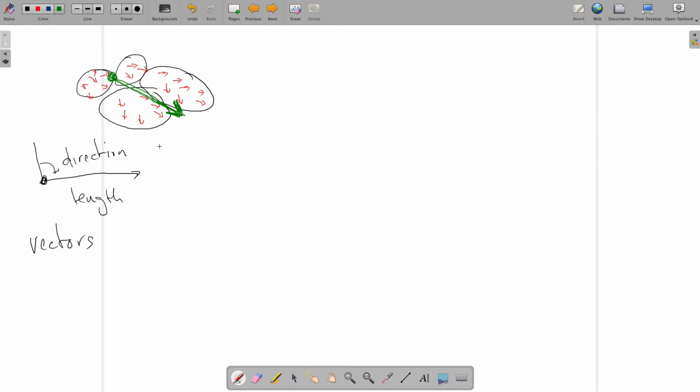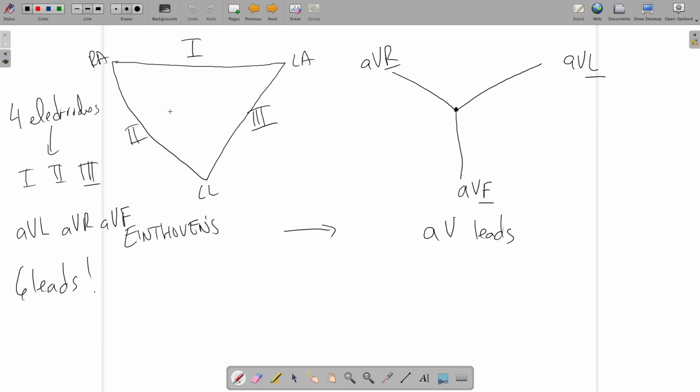So why do we care about that? Well, here's why. Because now what's missing from those previous graphs, we talked about all these things, Einthoven's triangle and the graphs here. Now we need to kind of look at how we can apply that clinically and what difference that makes for us. So while we're back on the screen, I want to talk for a moment about all of the polarity of these leads.